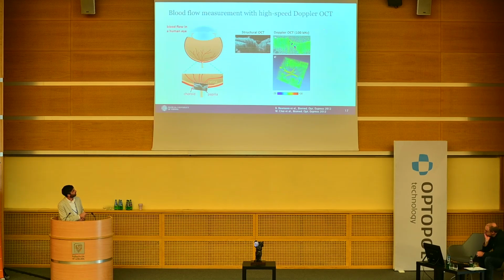This is at 100 kilohertz, and if we, for example, take a cross-section at this position, we can, in single vessels, convert the velocities into flow rates for given vessels, which, for example, for these 3 vessels are around 10 to 30 microliters per minute.